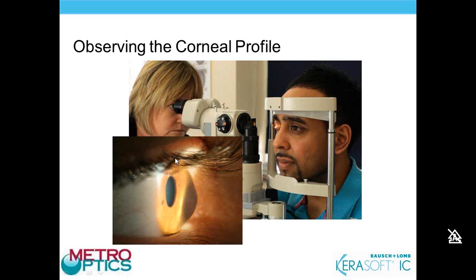And we all know what a typical corneal shape looks like on a normal patient. We have a feel for it. So you can actually tell when you're looking at this corneal shape whether it's steep or flat with reference to what we're most familiar with looking at.